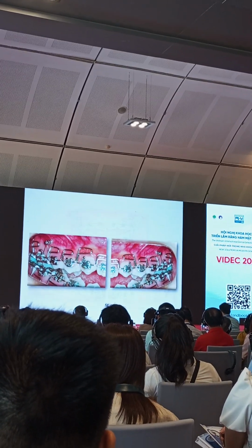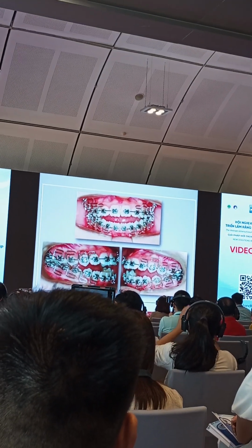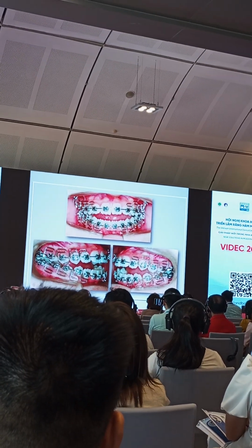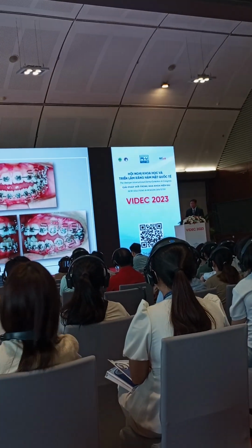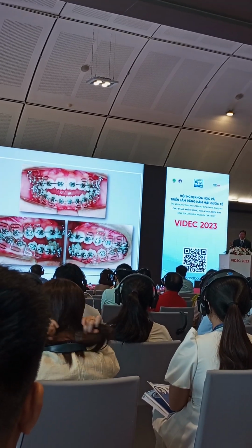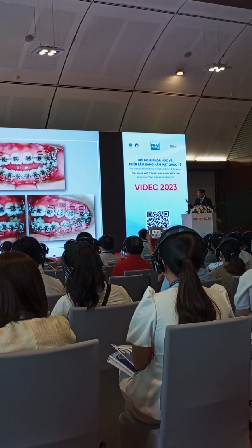Okay, so when the patient came back, it did not close. Because this time the patient is not wearing any elastics, even if you try to ask her to wear. So I'm just relying on my intrusion of my posterior segment with the help of the mini implant. So try to do it.